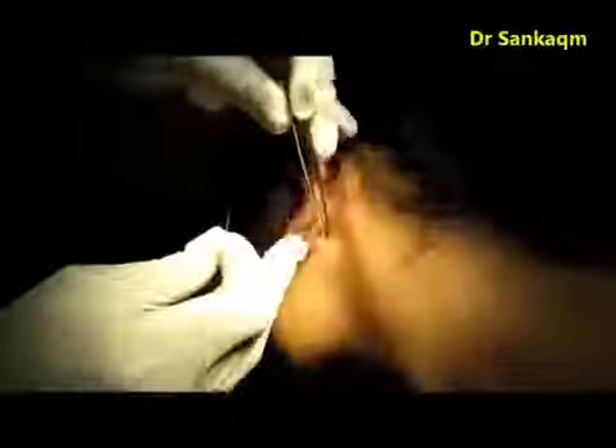But while stitching after surgery, we usually do the reverse. We first stitch the anterior surface followed by the posterior surface. This is the reverse rule.